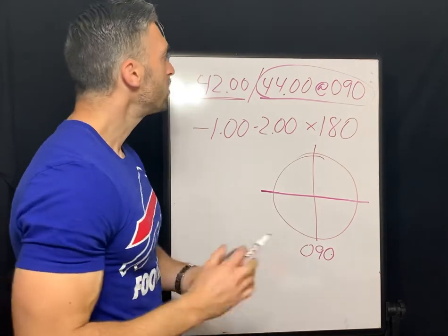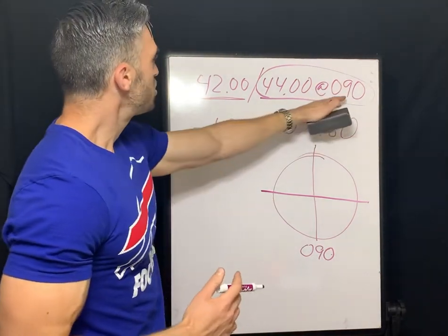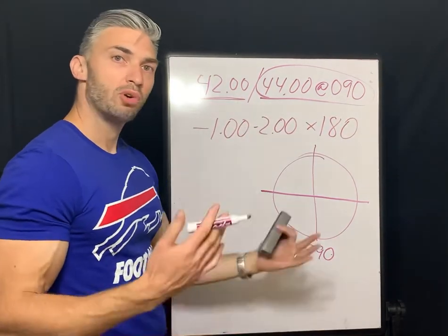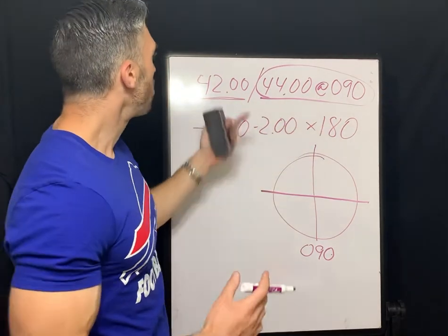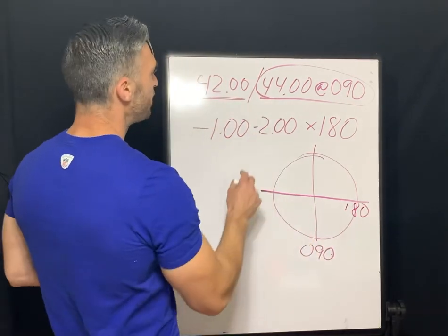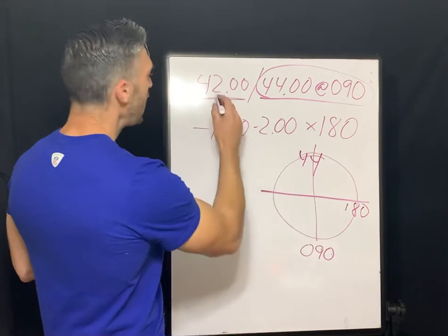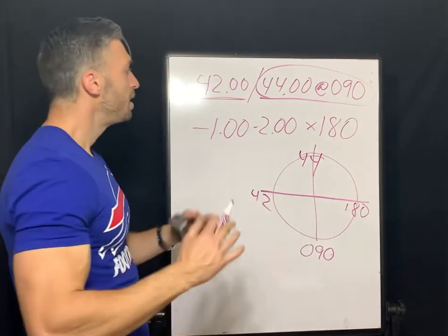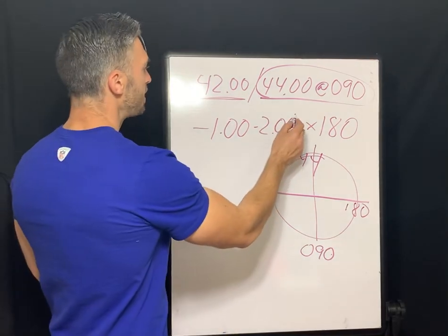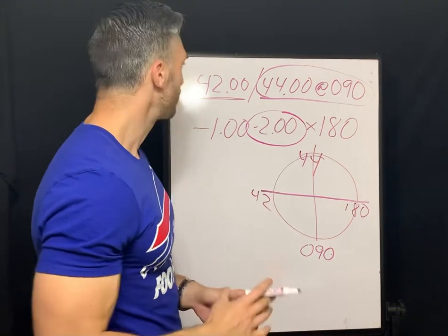So this is a regular astigmatism, not irregular. We're going to assume that the strongest and weakest meridians are 90 degrees apart, so 42 will be at 180. At 90, we've got a 44 K. At 180, we have a 42 K. But here's our prescription. From our prescription, we see that there are 2 diopters of astigmatism, or cylinder power.